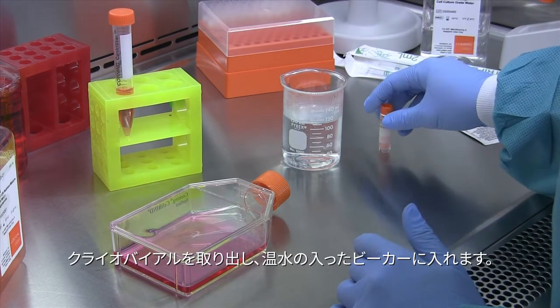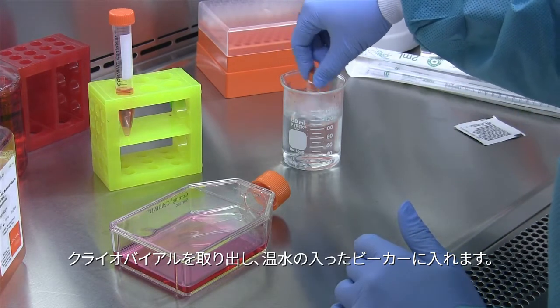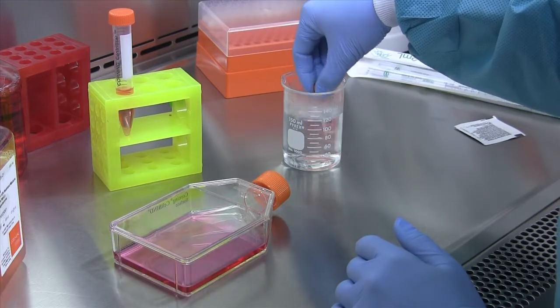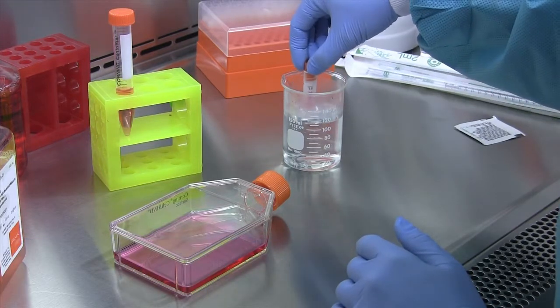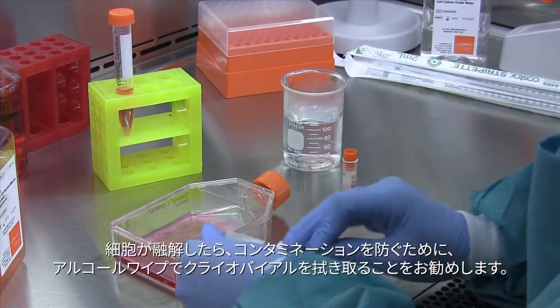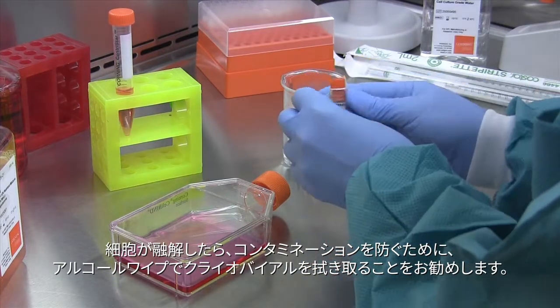To thaw out the cells, you take your cryovial and put it in the beaker filled with water. Once the cells have thawed, we recommend wiping down the cryovial with an alcohol wipe to reduce the chances of contamination.